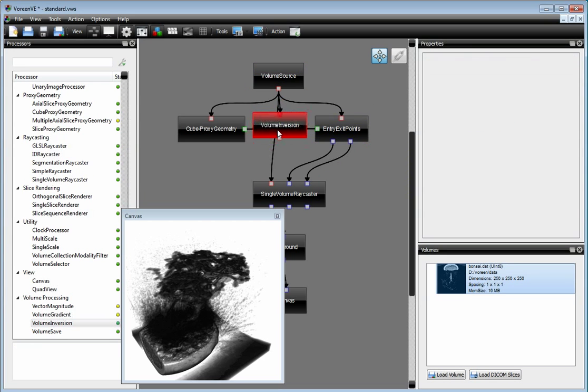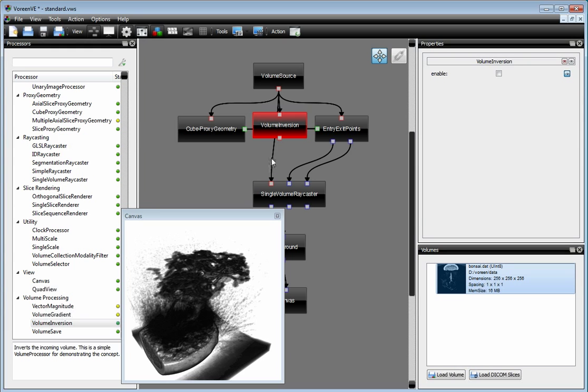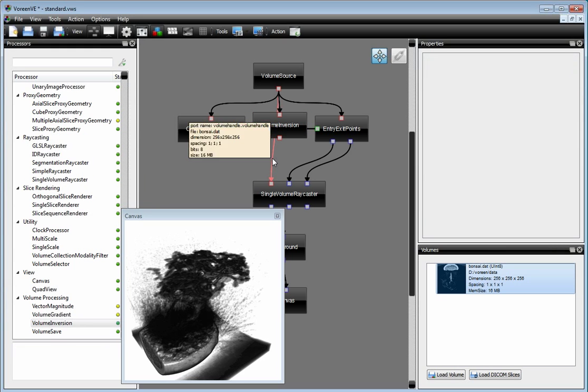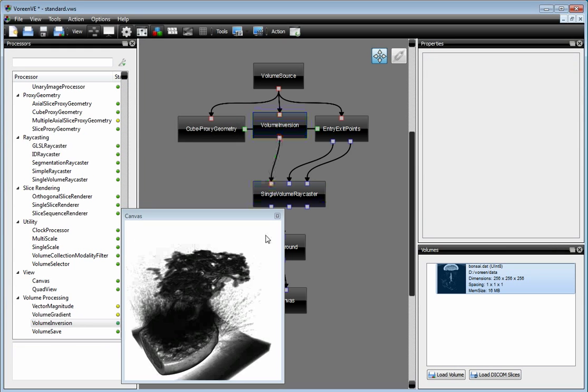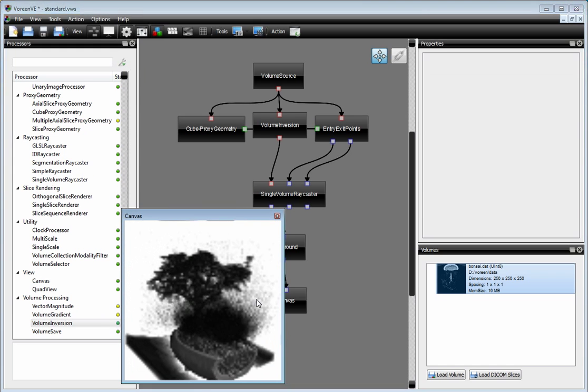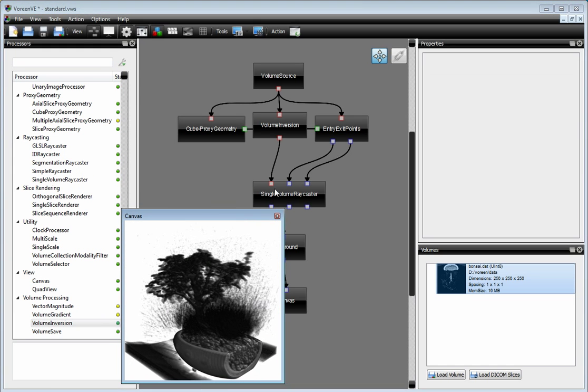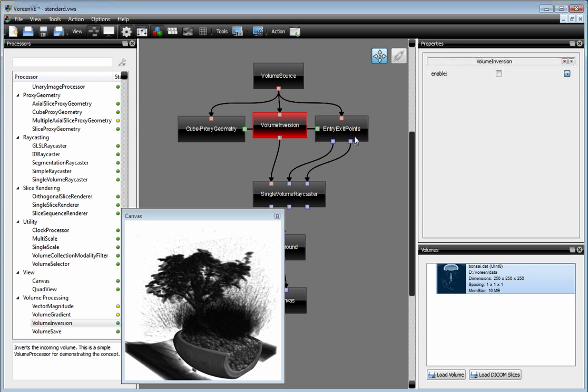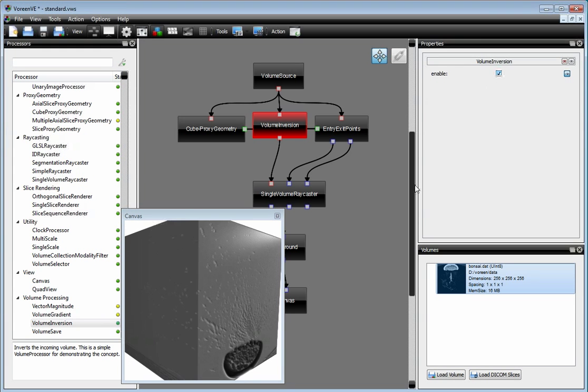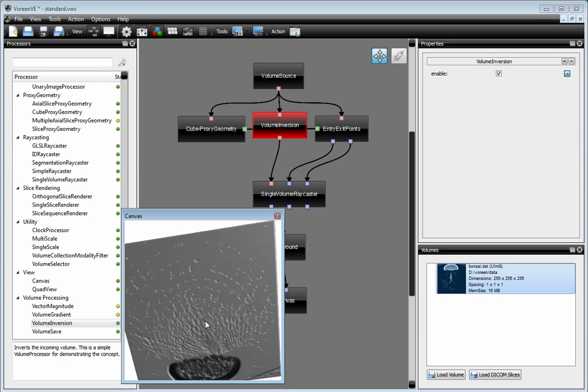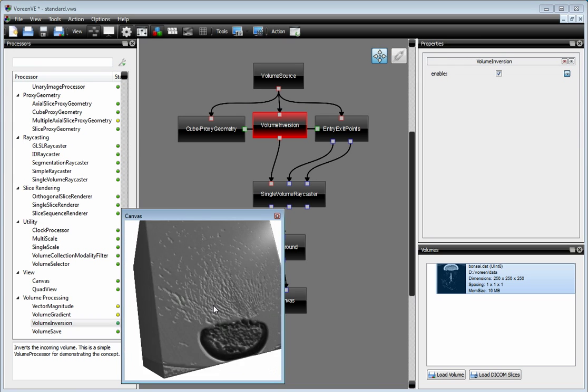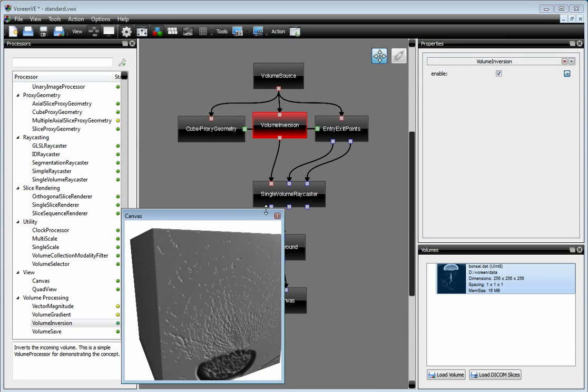Let's put it here. And then we don't use our original one for the rendering, but we use the inverted one. Now we have to enable this because it's a performance hungry operation. And you can see now we have the inverted dataset here.